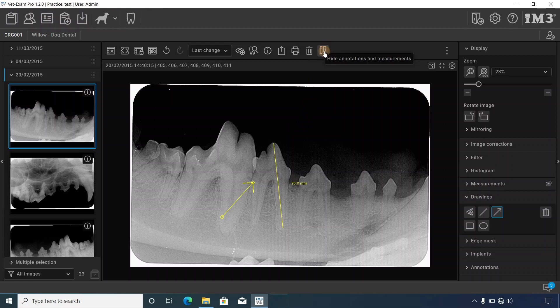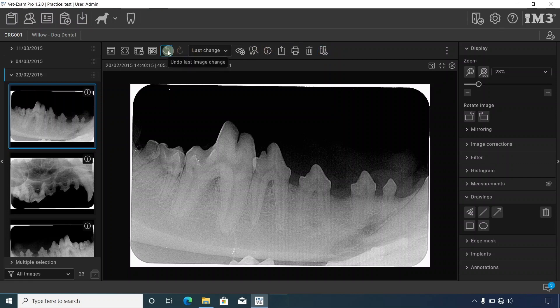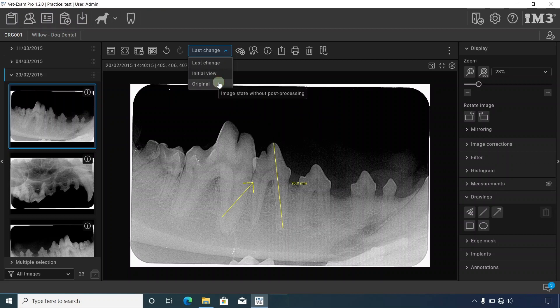You can hide these annotations and measurements by clicking this icon to return to the original X-ray. For previous edits, use the back and forward arrows or dropdown to access last change, initial view, or original.